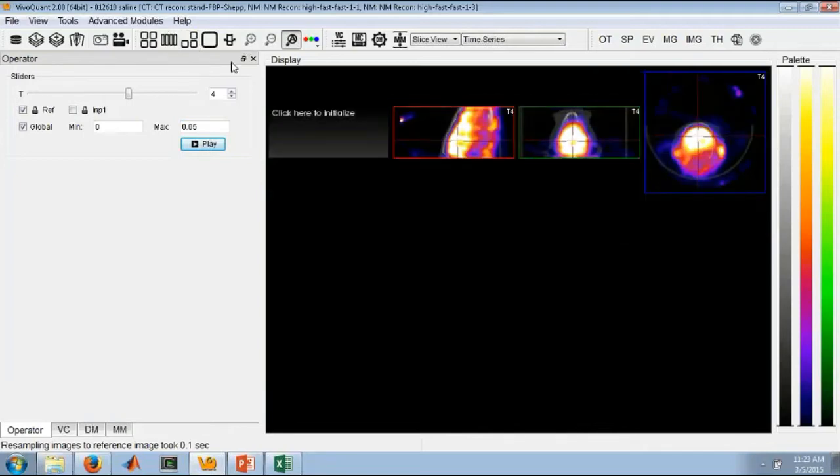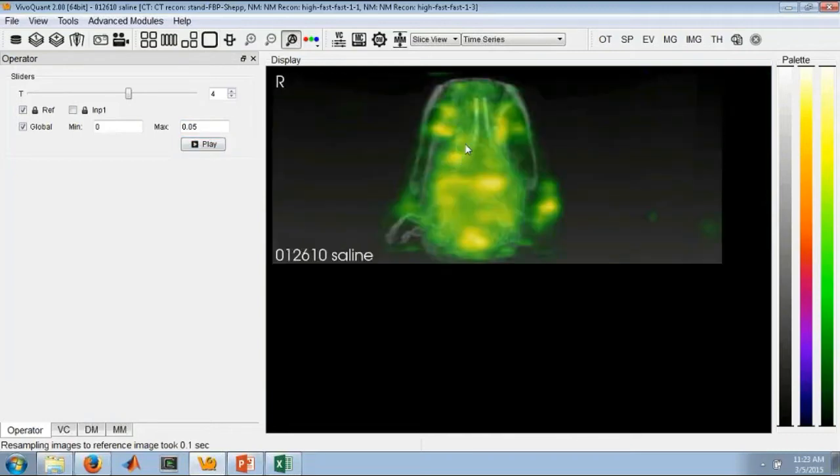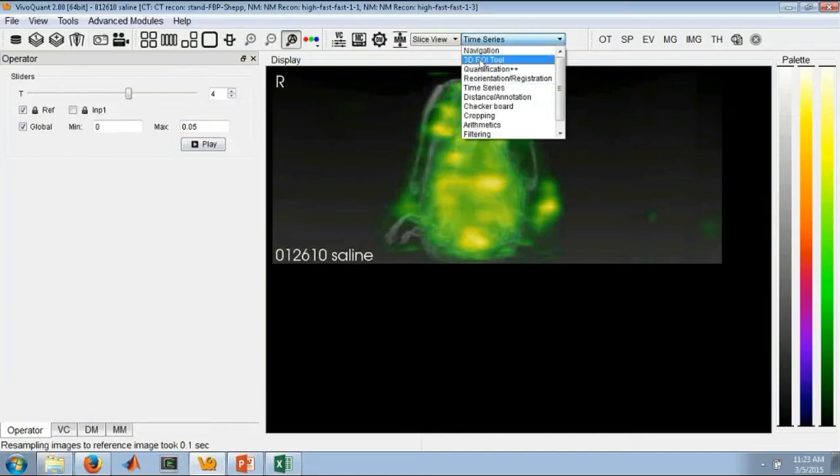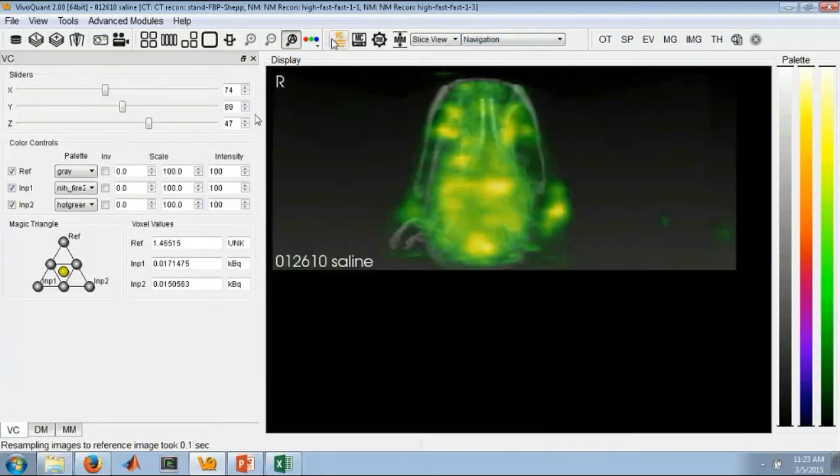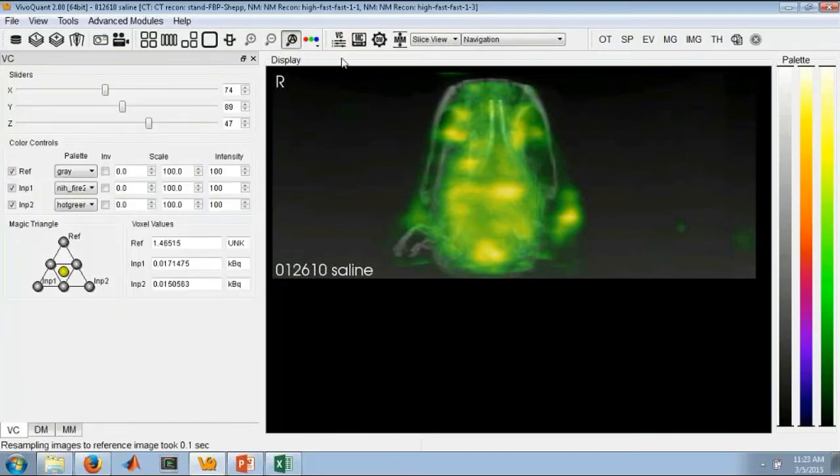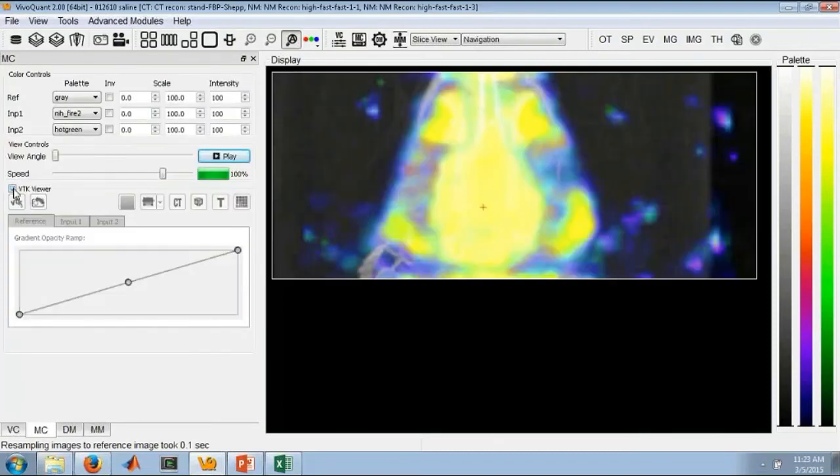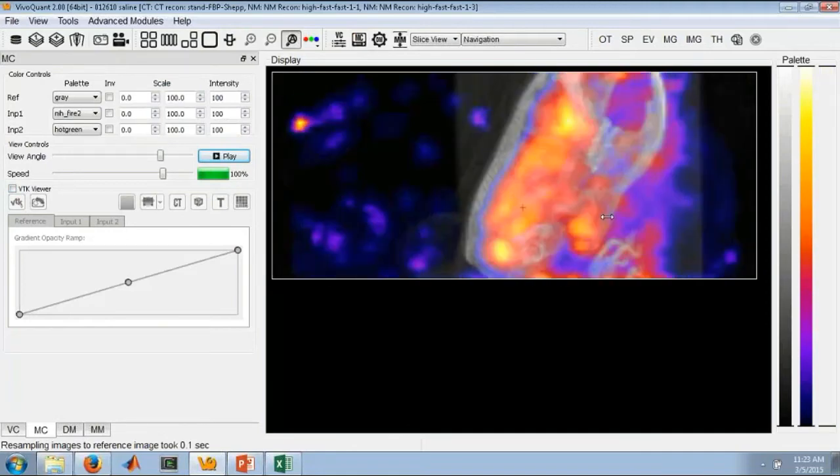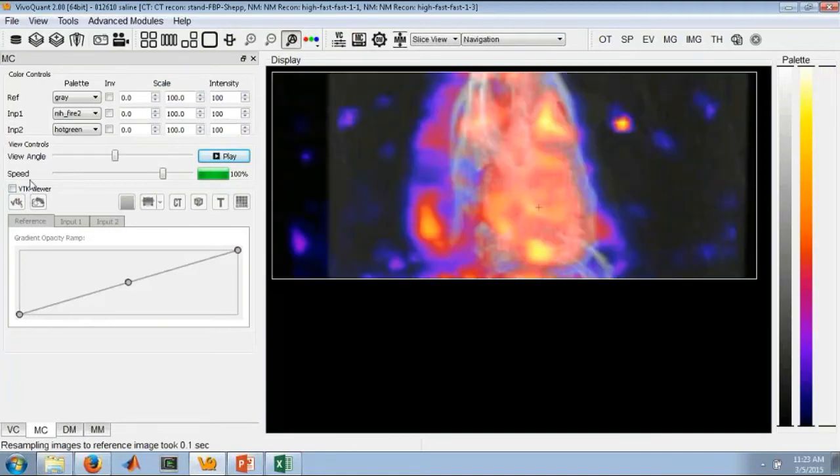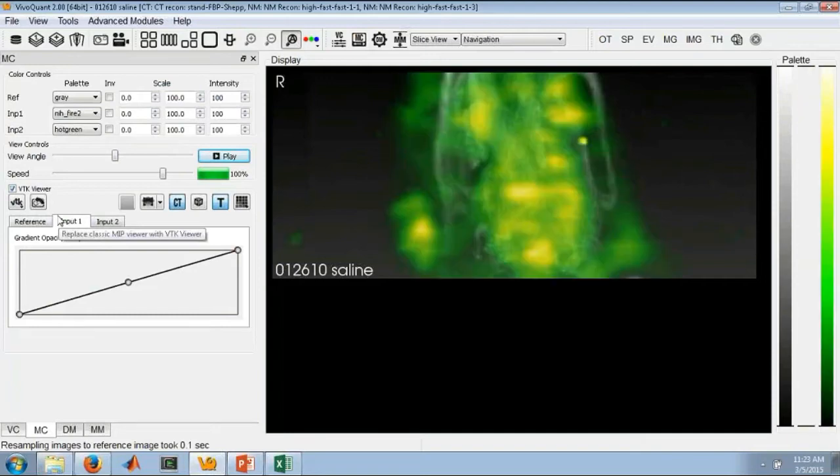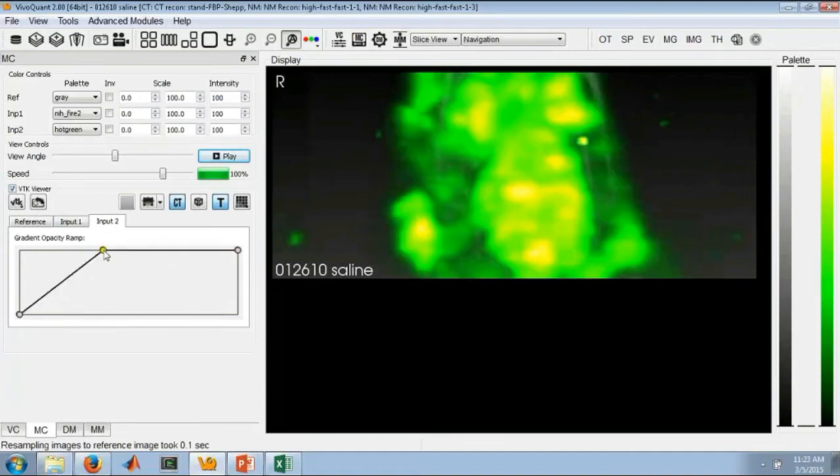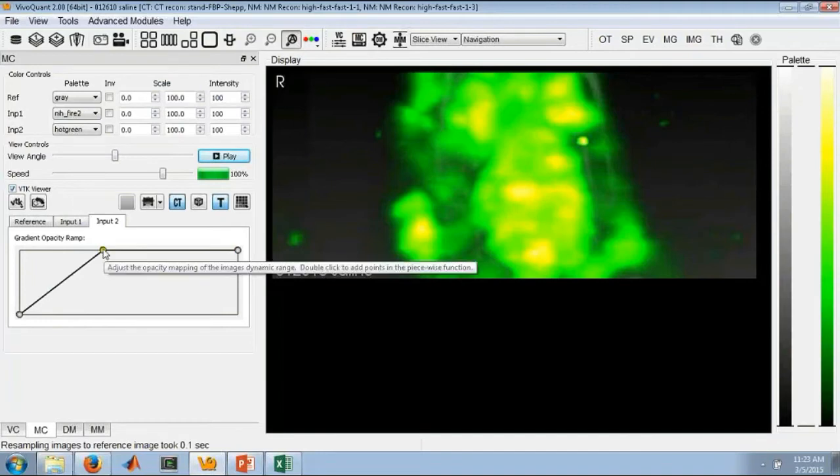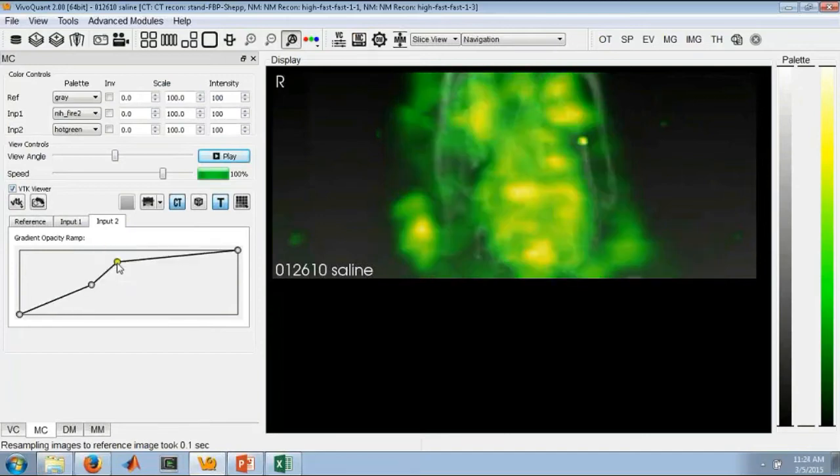We've also added improved viewing in the 3D space. If we open our maximum intensity projection and initialize, you'll see here, while we still have maintained our classic MIP view, we've also improved our VTK viewer. Now, in the past, you haven't had access to this opacity gradient. Basically, what we've done is we've removed the external MIP viewer that we had previously and incorporated the opacity ramp directly into VivoQuant.